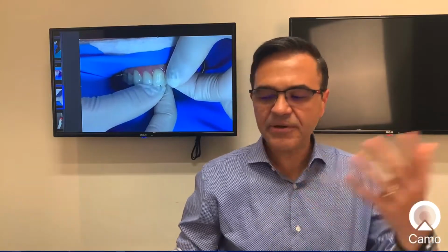Yes, I'm showing a video here for those YouTube fans. You place first the incisal edges with the microhybrid, okay, like I showed you before. And then whenever you're going to close a gap or a diastema, then you put a Mylar strip. Then you do a little sausage of composite in between your fingers. Remember, you have to have in between your fingers the anatomy that you want to bring. If you want to bring a contact, you have to do it in your fingers before you put it in the mouth.